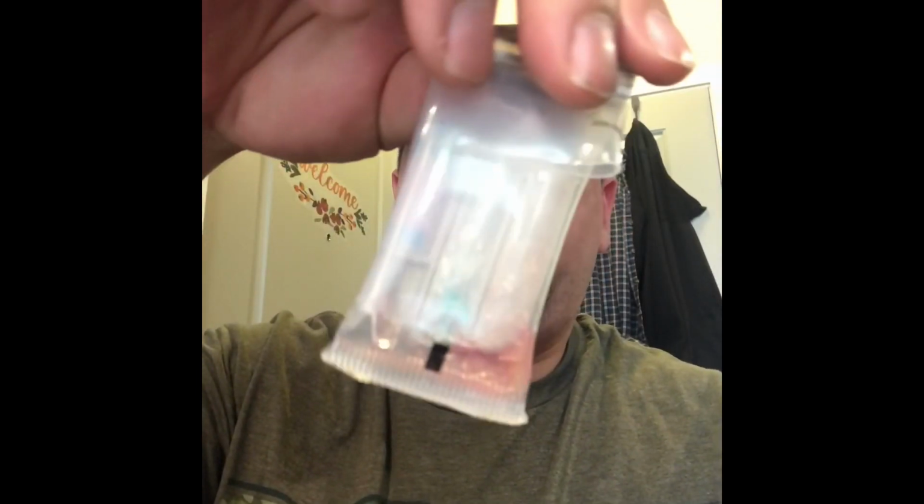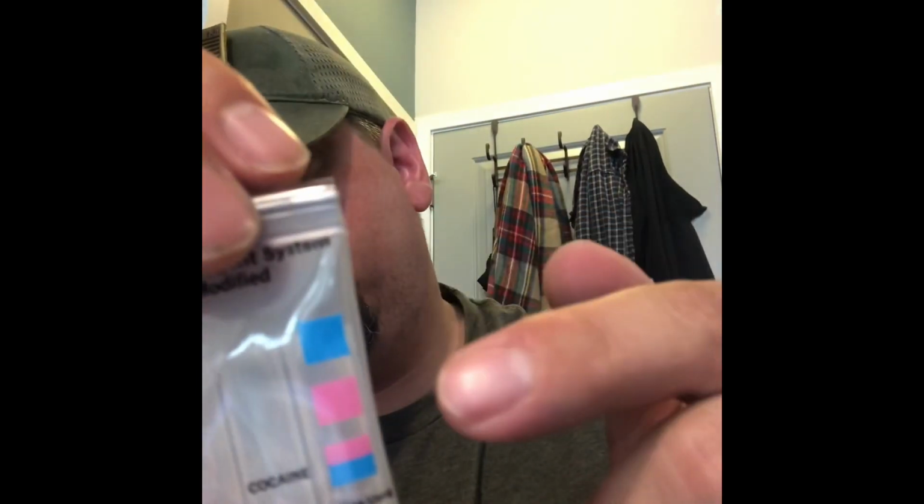Shake it around a little bit. It's got that bluish pink tint, which is what you need. Blue, pink, or blue and pink together. Break the third. Where are we going from here?